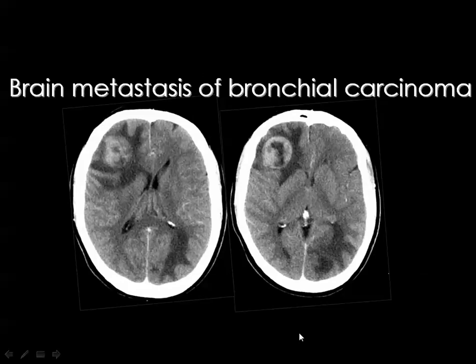Then, in our clinical practice, whenever we encounter a patient presenting with brain deposits, multiple lesions in the brain representing metastatic deposits surrounded by a considerable amount of brain edema, and we do not know the primary pathology in this patient, then the first site to look in is the chest. And if we encounter a patient with brain metastasis as a first presentation, we should look in the chest by plain X-ray, and many times we can elicit the primary malignancy.